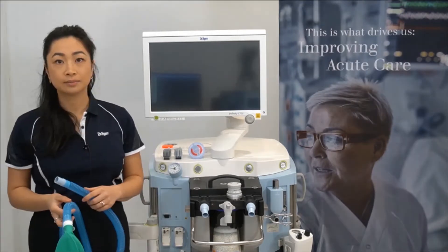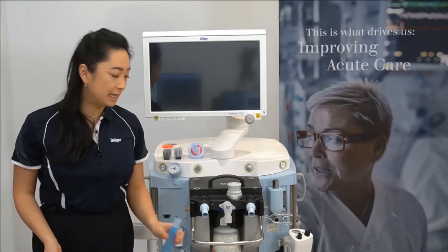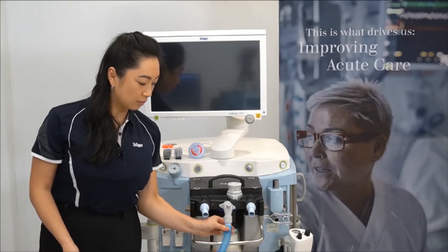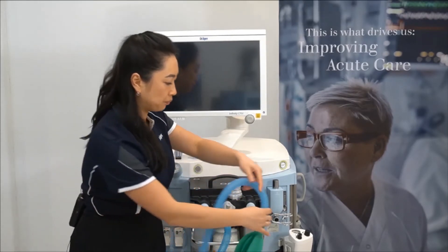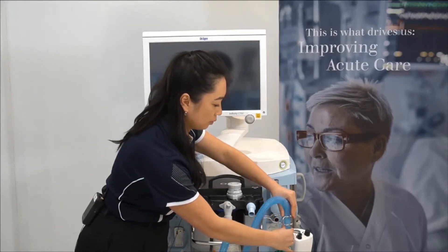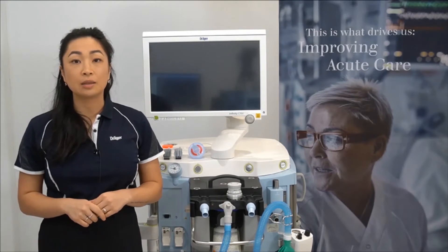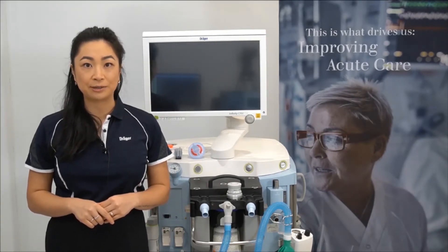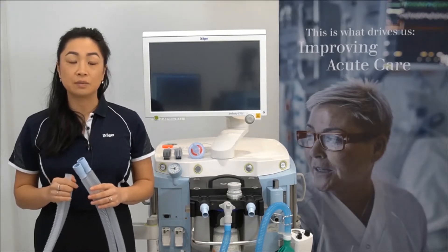Now to attach the breathing circuit, starting with the bag limb. This can be connected to the middle grey port of the breathing system, with the other end hanging in the bag receptacle. The breathing bag should be pointing downwards so that the pressure in the breathing circuit can be accurately measured.